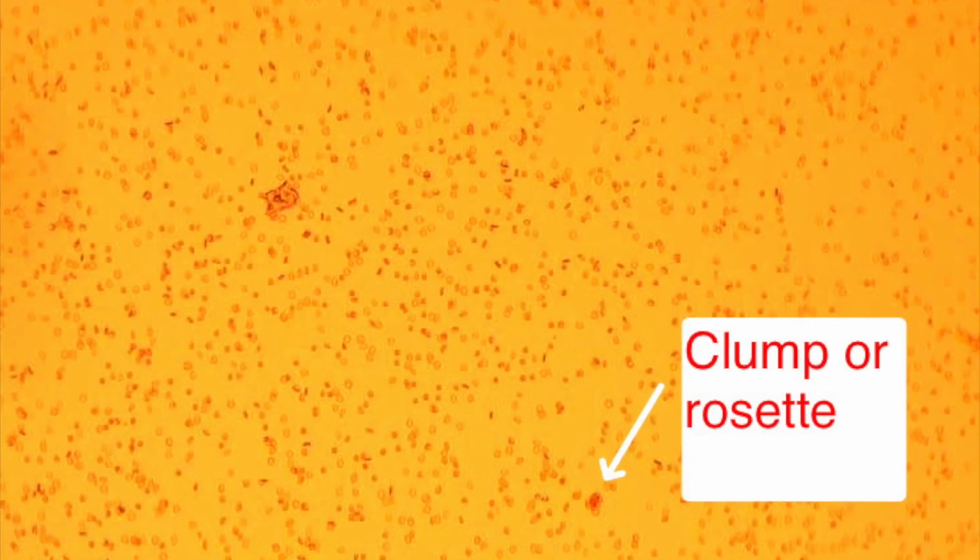Here is an example of a negative fetal screen. You don't really see any clumps on this one. Now we're moving into a picture of a rosette. There's an example for you. And on this one here, as you're scrolling through, there are a lot of clumps. Okay, so you can see that. You need to look at 4 to 5 fields to establish and get your estimate of your fetal screen.